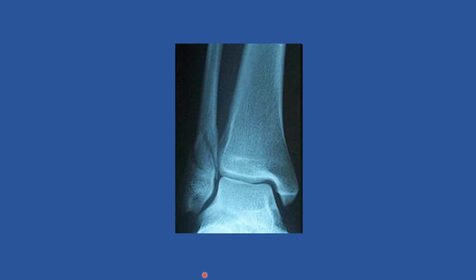healed. This fracture especially needs to go to ortho because it's not that far from the joint space. Any fracture that's near the joint space obviously is a bit more concerning. I think there'd be some concern for development of arthritis here in this joint.